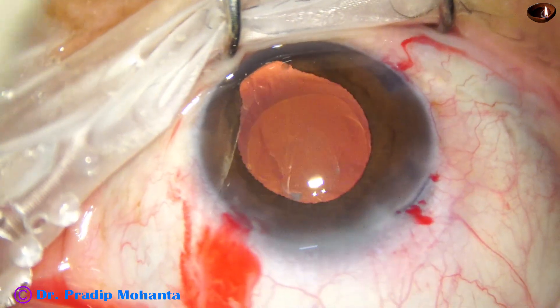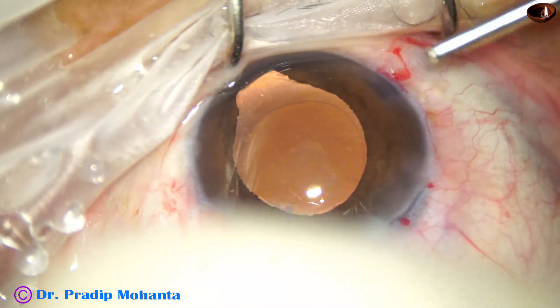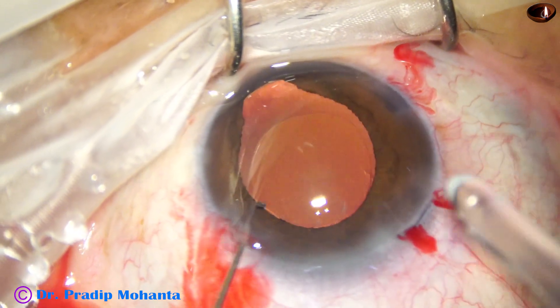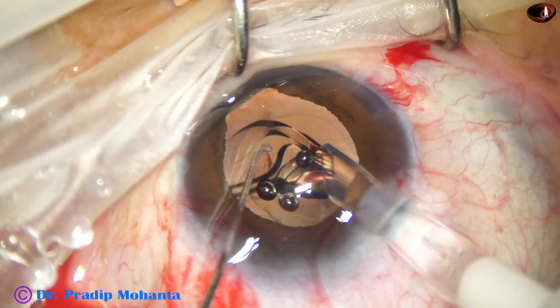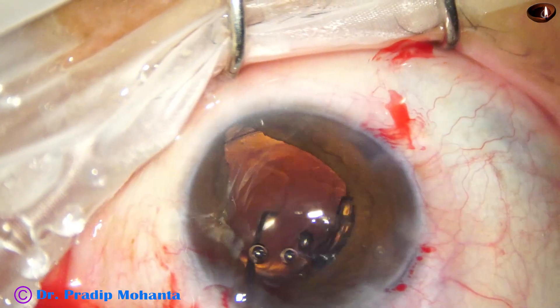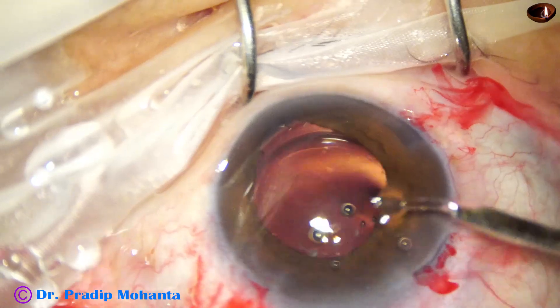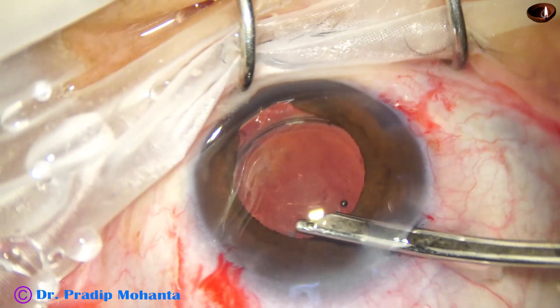Now is the time to implant the intraocular lens. I fill up the anterior chamber with visco. The lens for this patient is a Rayner hydrophilic intraocular lens with a power of 4 diopter. Here goes the intraocular lens into the capsular bag. One haptic of the lens is placed at the colobomatous area, so that it supports the capsule in this area with the zonular defect for about one clock hour.